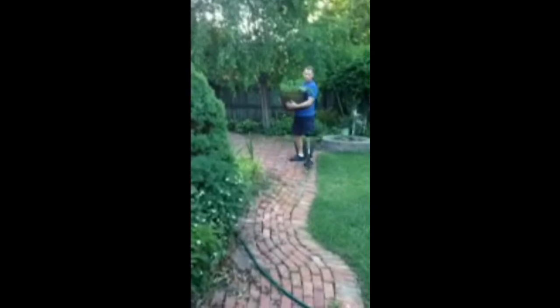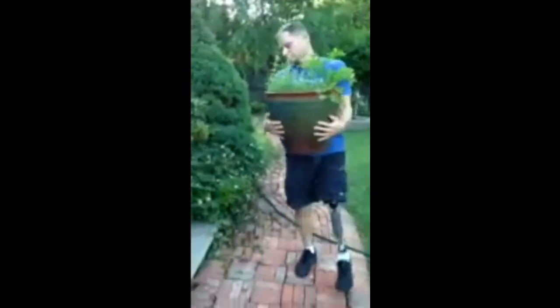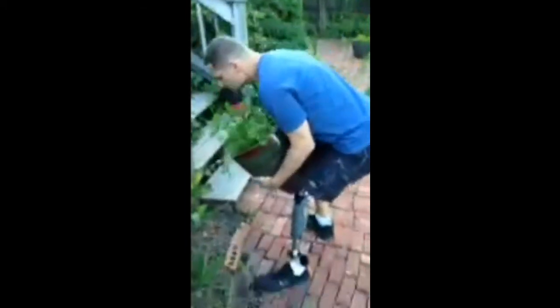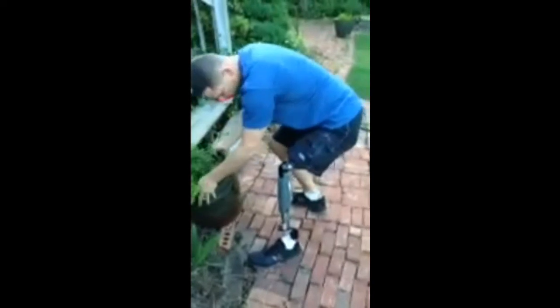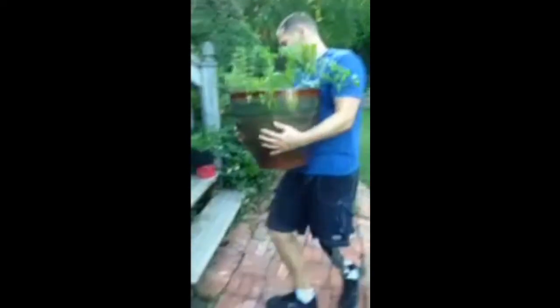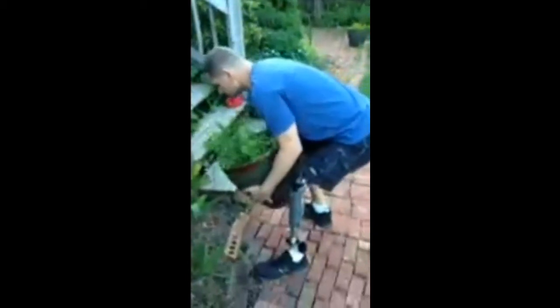Notice his use of the amputated side. Focus on the strength he's getting out of the amputated side. Focus on the stability of that knee. Focus on how it allows him to use that knee, not only for balance while carrying a heavy object in an awkward position, but stability.